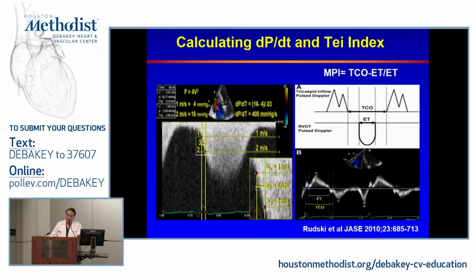This index on the right side has been looked at in patients with heart failure, has been looked at in patients with cardiac amyloidosis, and is associated with outcome. Having said that, we do not typically rely much on it. We rely more on other indices. One of them we already talked about, the fractional area change. What's the upper limit of normal if you use the pulse wave Doppler method that we just talked about? The upper limit is 0.43.